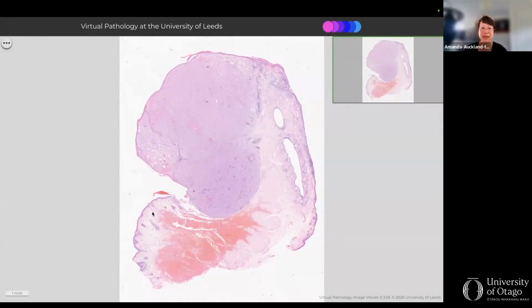Okay, this is very interesting. It looks like, to me, an eyelid wedge that's cut in parasagittal section. And how can I tell that? I can see on the left side, there's skin, because it's got adnexal hair follicles. And then if I go to the other side, it's got an epithelial surface, but right underneath at this power, I can see it's got meibomian glands, so that's the tarsal plate. And in between both of them, there are big thick bundles of muscle, which must be orbicularis oculi. And then down the bottom, this confuses people, there's a lot of blood, but that's because of surgical trauma.